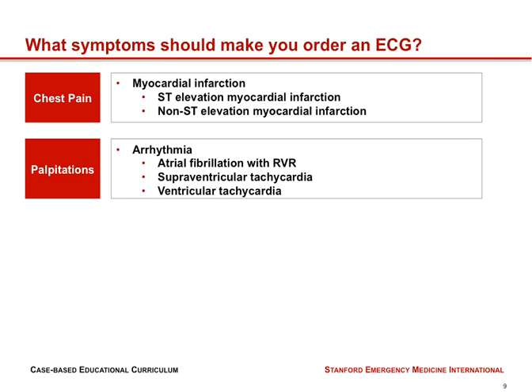Ventricular tachycardia is where the ventricle itself is rapidly beating on its own, and the QRS complex, instead of being narrow, is very wide. Now, I'm only telling you this not so that you can identify each of these, but so that you can be, in a general sense, familiar with the concept that a change in the shape of the waves on an EKG from their usual pattern may be associated with something dangerous. And of course, we encourage you to do further reading on your own about these types of arrhythmias so that you can identify them on EKGs.